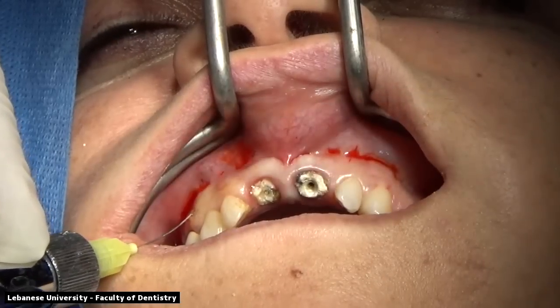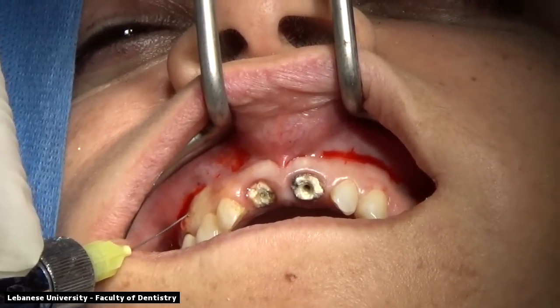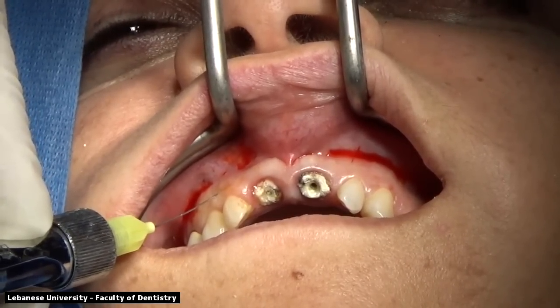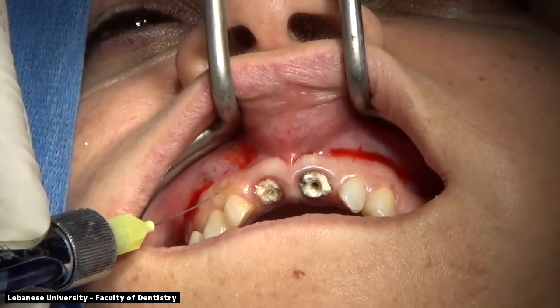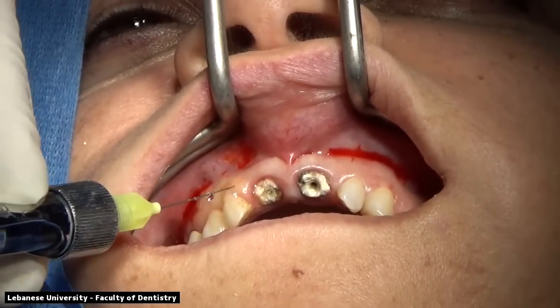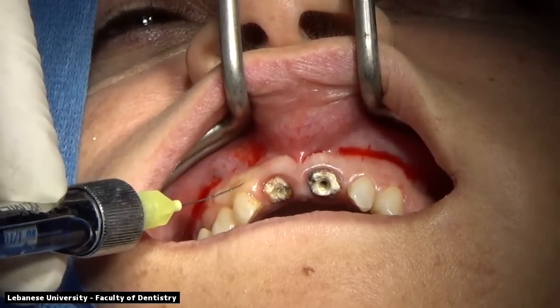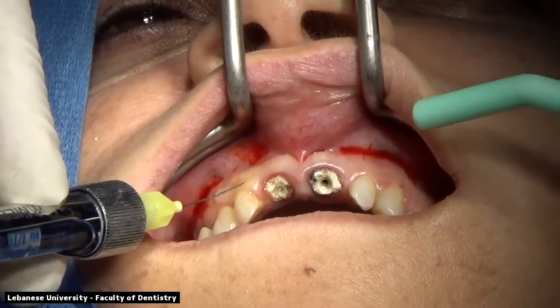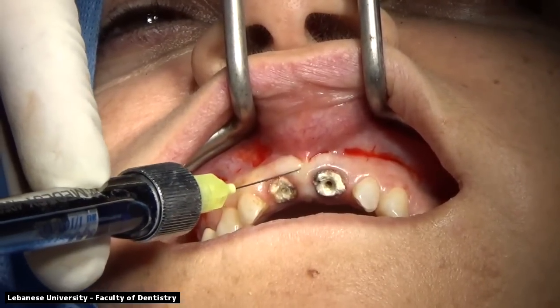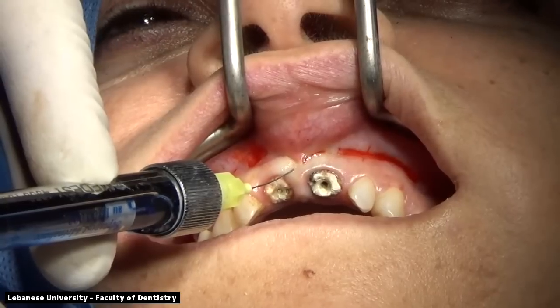And at the same time, if you notice, this patient has different gingival margins. The 2 central incisors are at a higher level than the canines on both sides bilaterally. So a crown lengthening procedure will be done to place the gingival margin of both central incisors at the same level as the canines, and the lateral incisors will be placed 1 millimeter below the centrals and the canines to create a better gingival profile for the patient and a better aesthetic smile design for her.